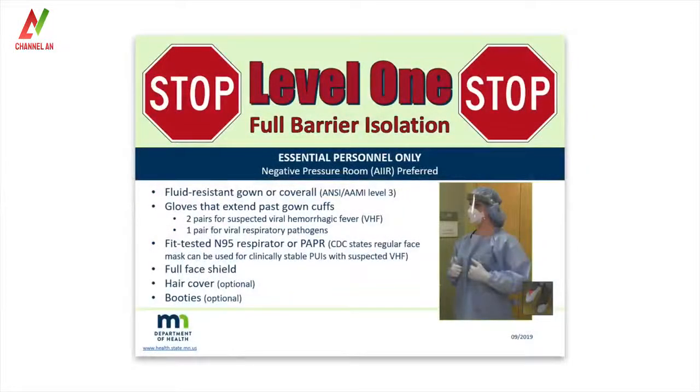This video shows how to don and doff personal protective equipment, or PPE, used for high-consequence infectious disease level 1 full barrier isolation. These guidelines are adapted from CDC guidance.